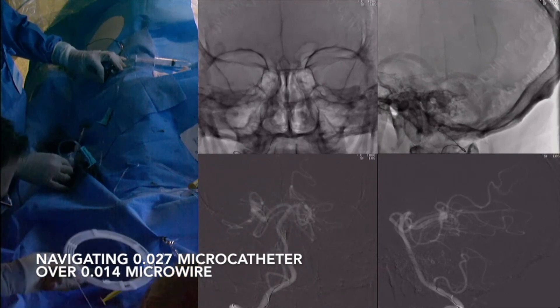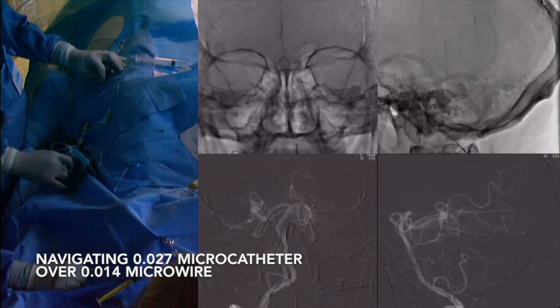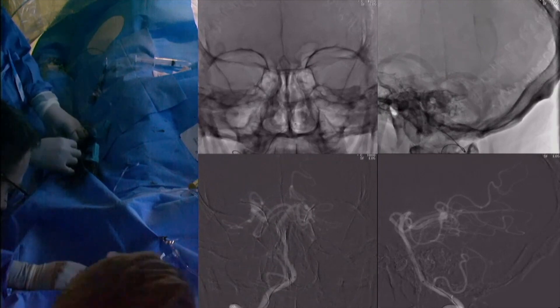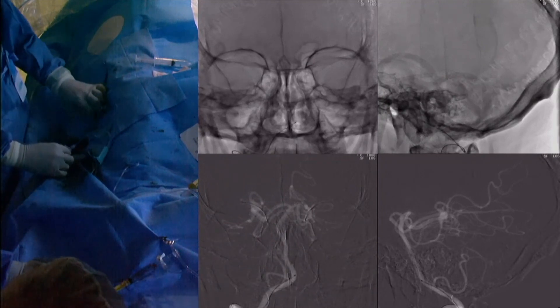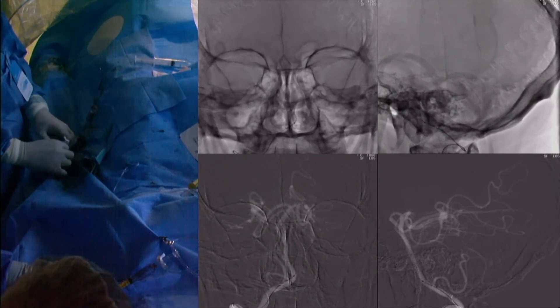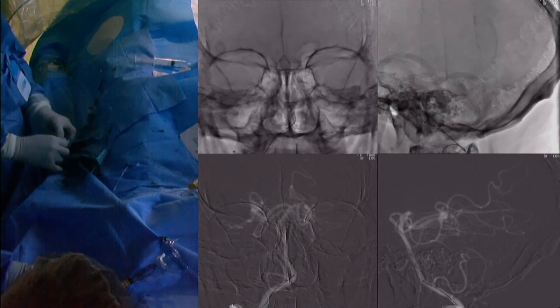This is an 027 microcatheter, big enough to deploy a flow diverter. Here we see the microwire being advanced into the proximal, mid, and eventually distal basilar artery.